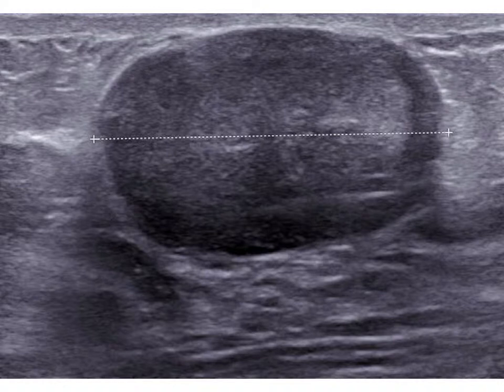First, do you see the white border surrounding this tumor? This is called a capsule. In benign tumors, this completely surrounds the mass. A capsule happens because the growing tumor has pushed the surrounding tissue out of its way, compressing it. The compressed tissue forms the capsule.